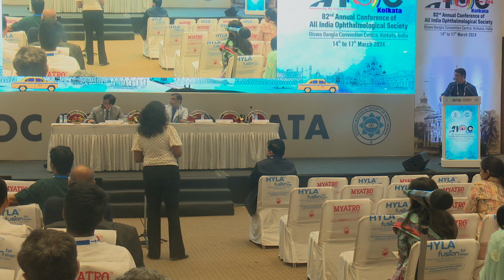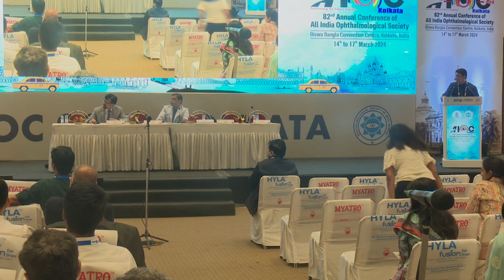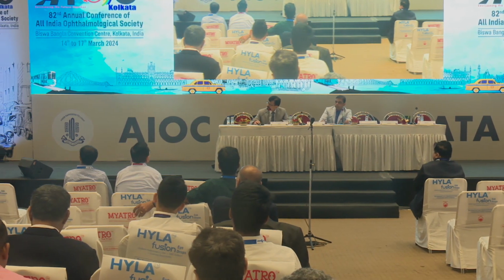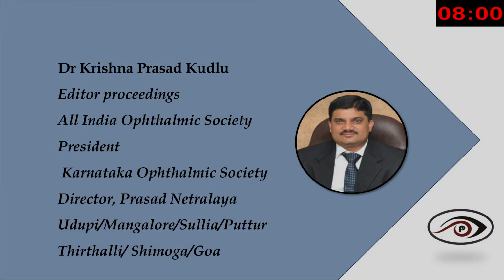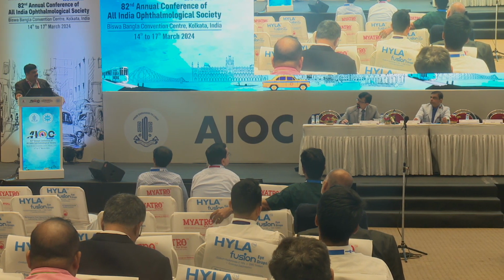I do up to 48 also. I got an old microkeratome from Amadeus 2. Actually, it works on the keratometry reading, and depending upon that, we can adjust the hinge. But that microkeratome from the last 10 years is not available in the international market. With that, according to them, you can go up to 48, 49 also. I have done it, and I never faced any buttonhole.